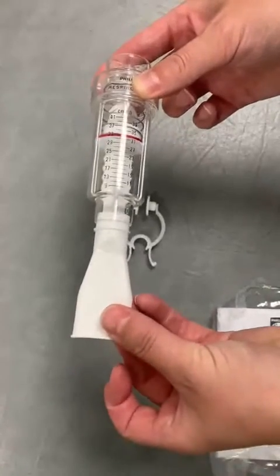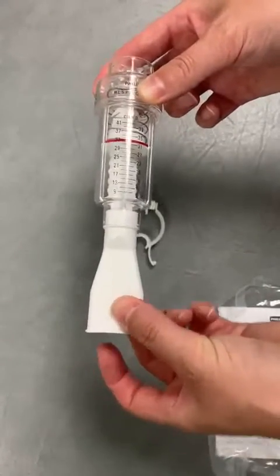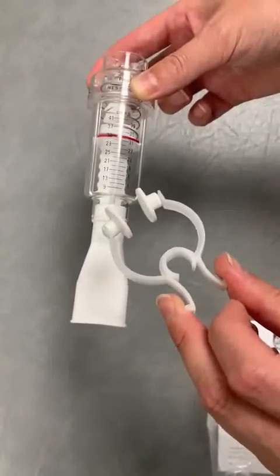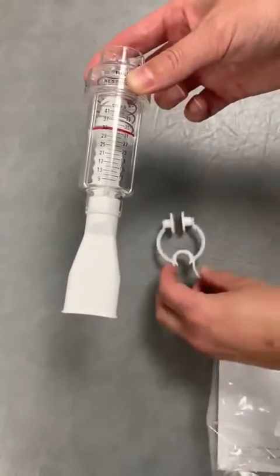You then place the mouthpiece over the dial at the end, and then for the nose clip, I normally get the patients to put it on themselves if they can, just because it's a bit more comfortable for them.